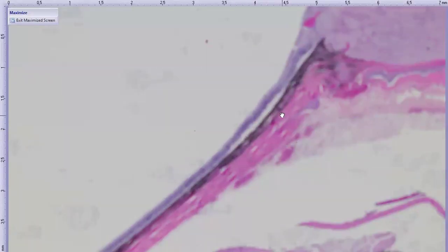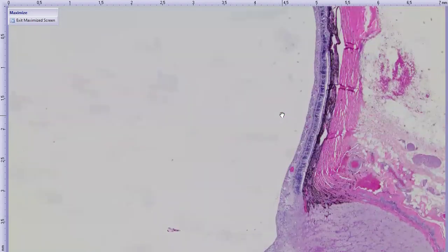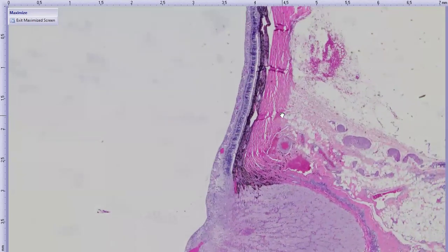Given the character of the trauma, can you see an intraocular coup contra coup with the vitreous mass? If it impacts and bounces around and traumatizes the retina, will you see optic nerve head changes? That's a good question. You'd see mostly retinal changes. Yeah, I would call it retinal contusion. And that will look like outer retinal atrophy.